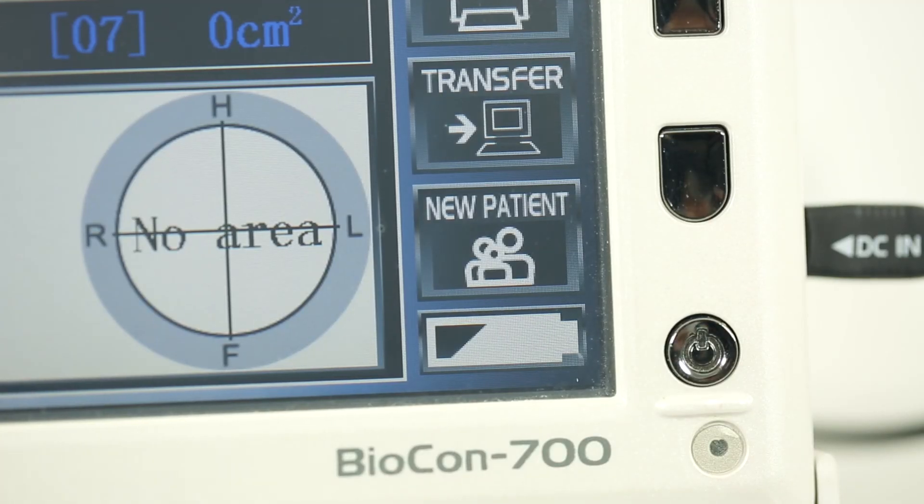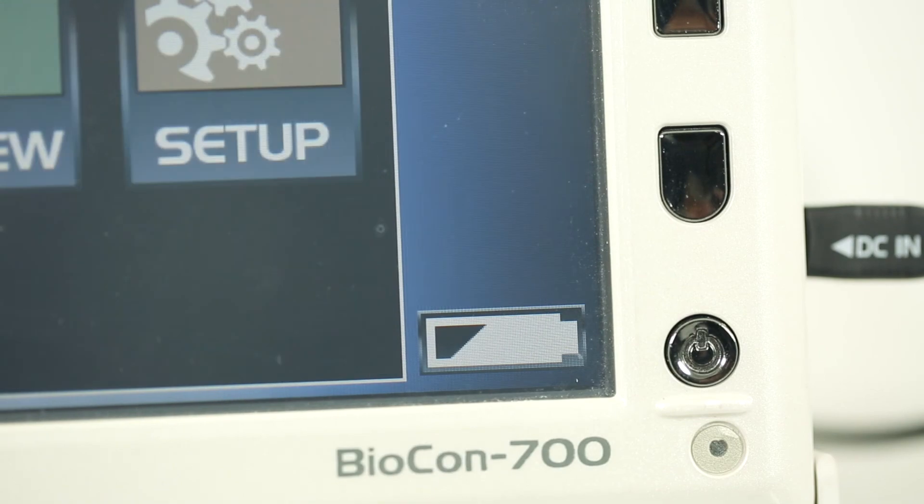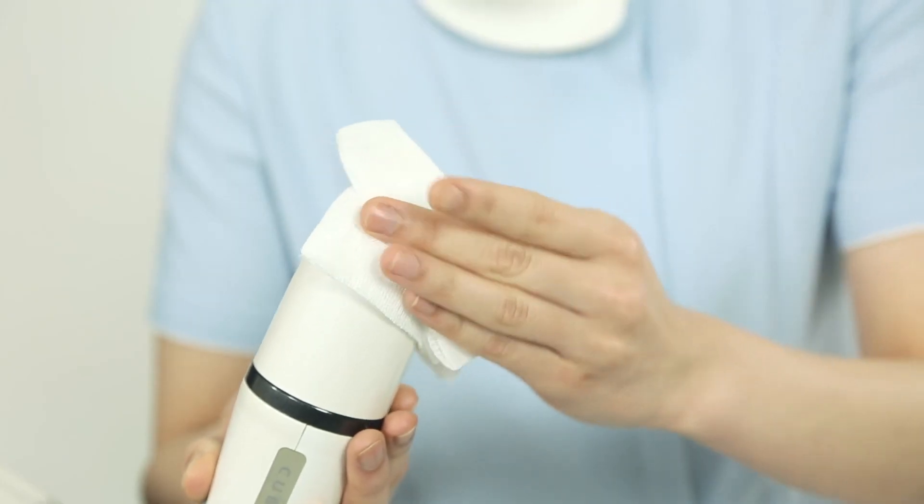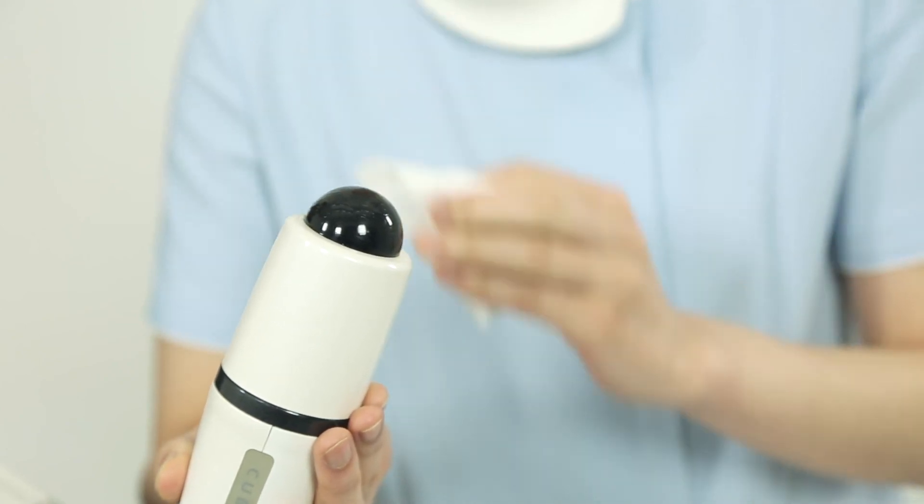To perform another measurement, touch the new patient icon. Once you've completed the scan, wipe the gel off the probe and the patient with a clean tissue.